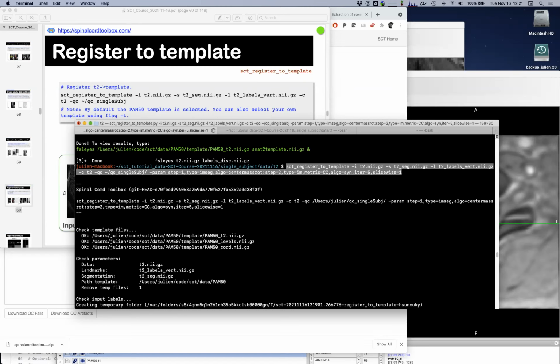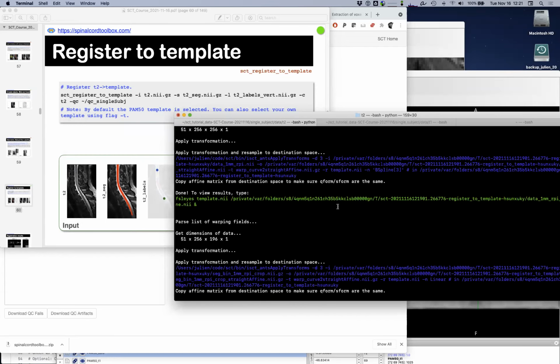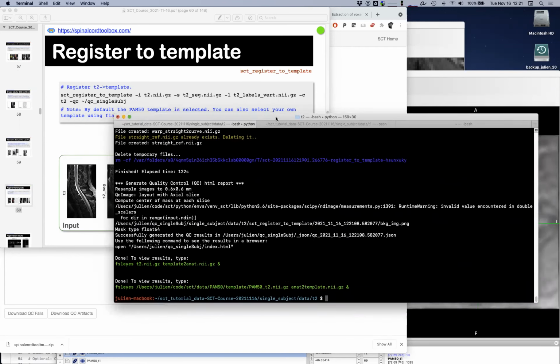Just a comment to everyone, the way that I call these functions is actually in MATLAB. In case anyone is in love with MATLAB and has lots of MATLAB experience, calling these functions using the MATLAB Unix command works well. I have all my commands and I can have it automatically look through directories and have text files of all the directory names. Then I call the commands from SCT from the Unix prompt. They're all done through MATLAB and I have no problems. Yeah, thank you, Rob. It's actually a very useful command.